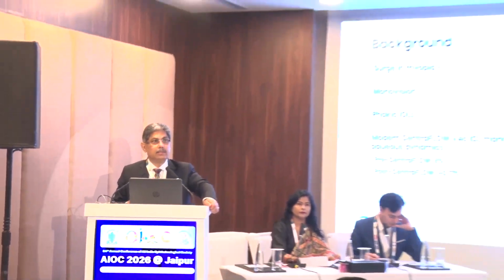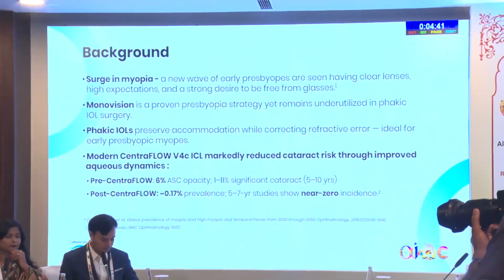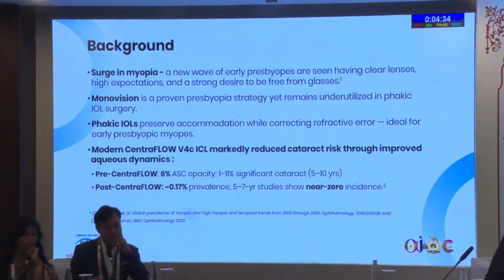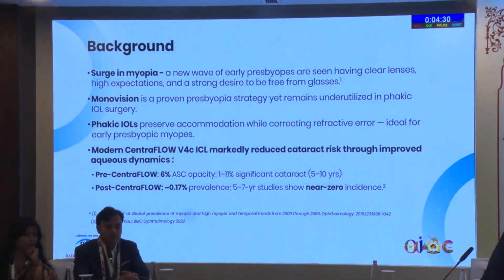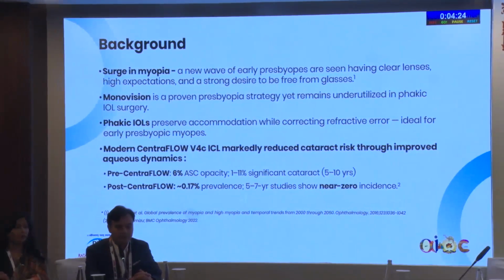With the background of the rise in myopia trends all over the world, there is a strong desire to get freedom from glasses. Monovision is a proven presbyopia-correcting strategy, but it is not utilized for phakic IOL surgery, and the modern Centraflow V4C ICL design has nearly zero incidence of cataract in the 5 to 7 years study which has been done recently.